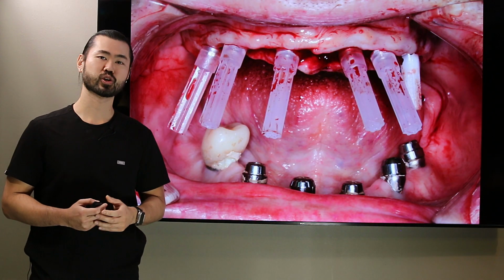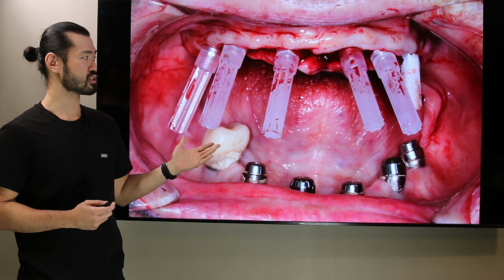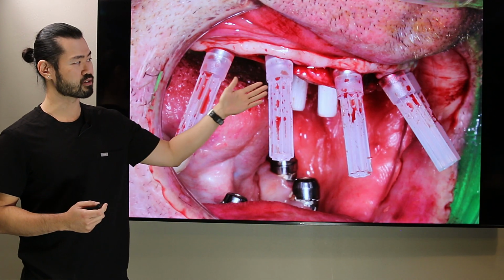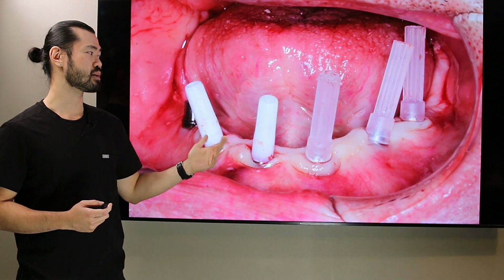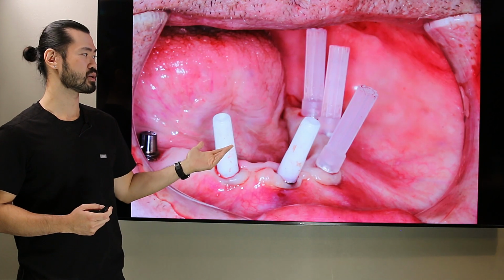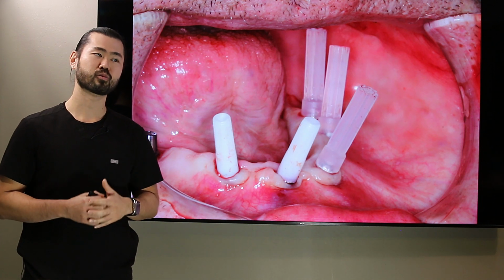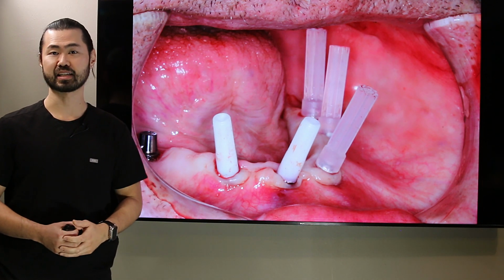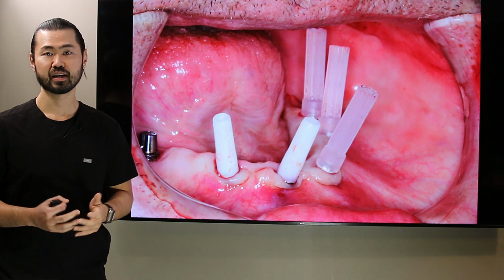This next series of photos shows an evaluation of the angle of the implants. From the front, it looks good, but once you turn to the side, you can see how the front implants seem to be sticking a little bit out of the mouth. The same thing is going on in the lower arch, where the implants angle quite far towards the front. This is a good example of how radiographs can sometimes be misleading. Even though the X-rays look good and the implants look straight on the radiograph, in the mouth it can be a very different situation.